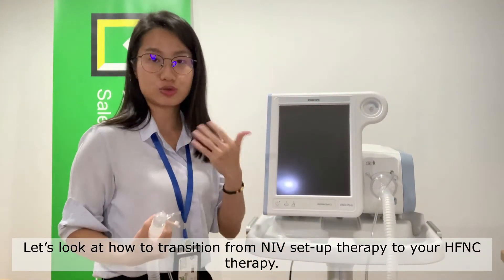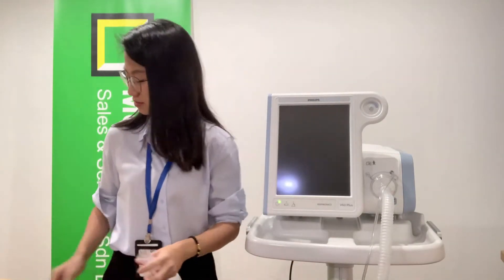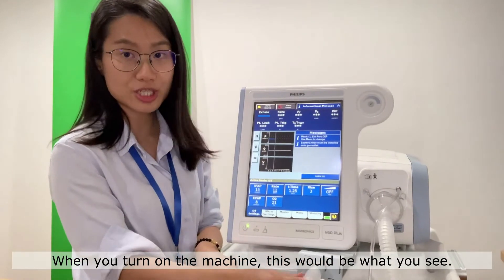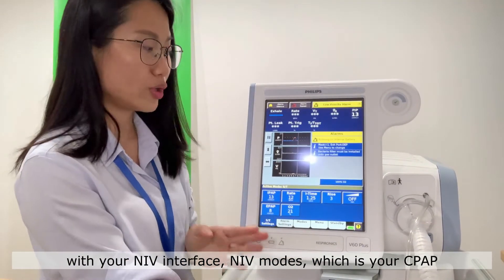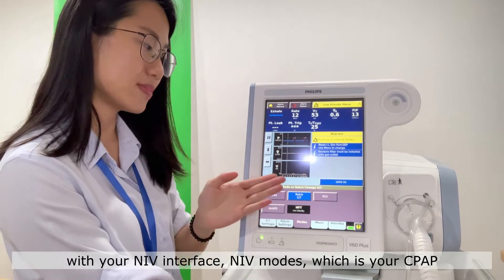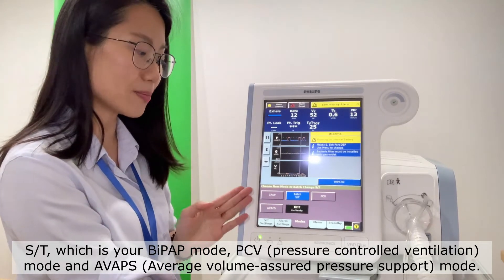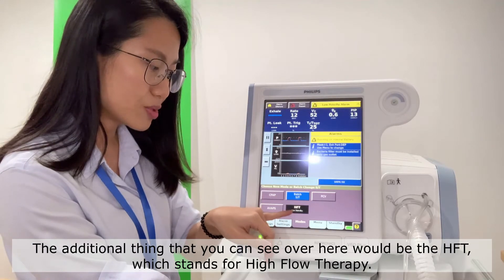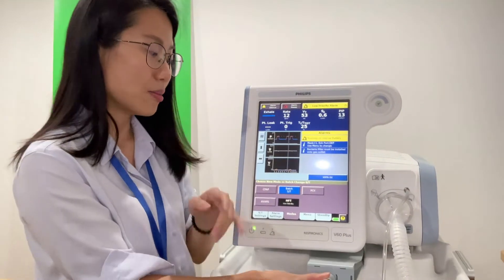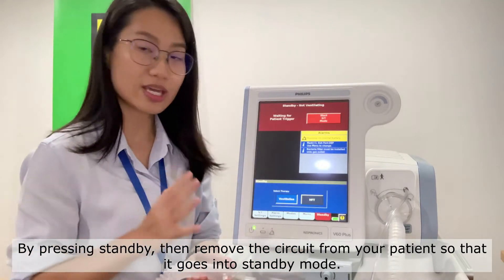Let's look at how to transition from NIV setup to your high flow nasal cannula therapy. When you turn on the machine, this will be what you see with your NIV interface and your NIV modes, which are CPAP, S/T — which is your BiPAP mode — PC, as well as your AVAPS mode, which is the average volume assured pressure support. The additional mode you can see is HFT, which stands for high flow therapy. To transition from NIV therapy to high flow therapy, press standby, removing the circuit from your patient so that it goes into standby mode.